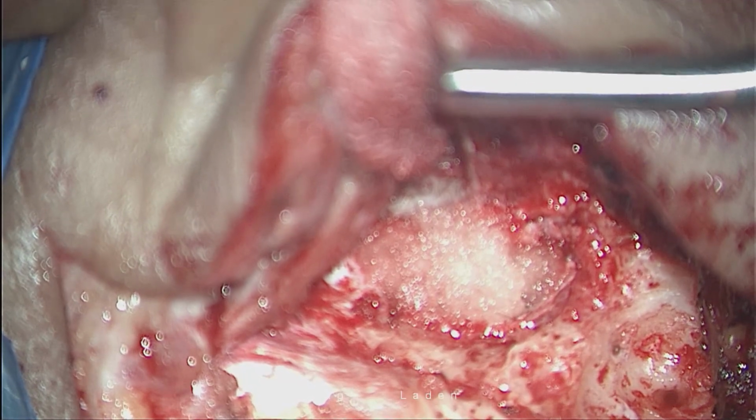Satish, if you had to do a lot of canalplasty, would you consider placing silastic in the external auditory canal? In the external auditory canal, see boss, I never place the silastic, for the reasons I will tell you. And less in the middle ear nowadays, it's lesser and lesser. But if you had an extensive drilling, stenotic canal? I am not of the opinion of doing extensive drilling, for the reason I will tell you.